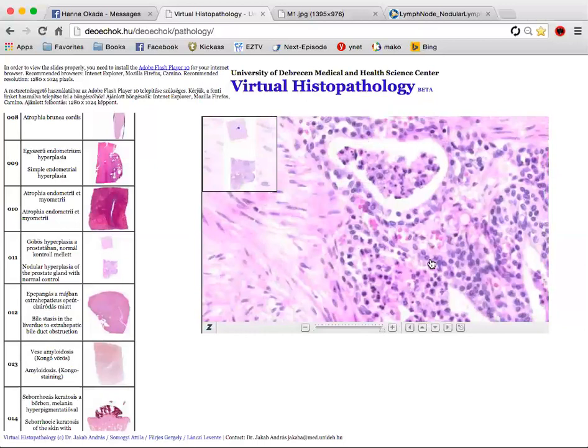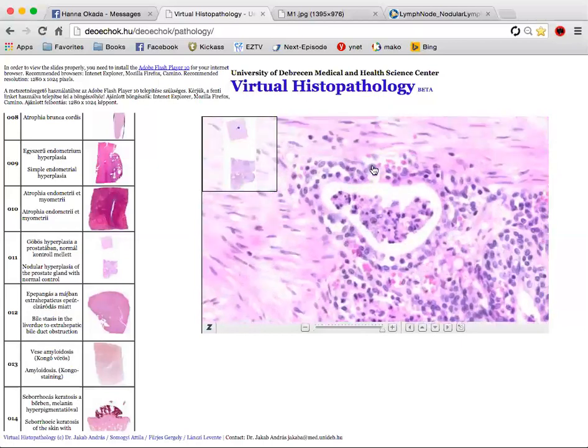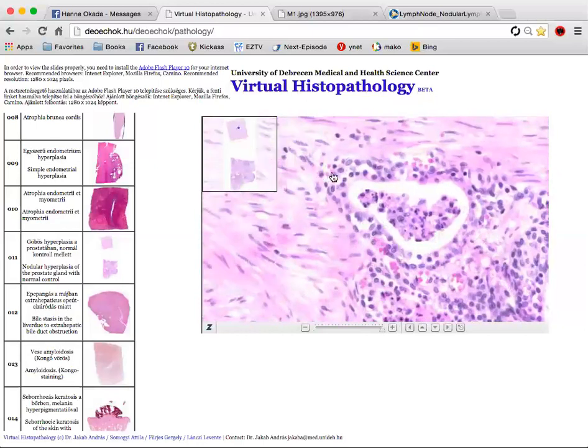These are just secretions that were not secreted outside, and they just accumulate. They're completely normal, not considered pathological, and the older a man gets, the more of these he has. You can see a lot of them all around the glands here.